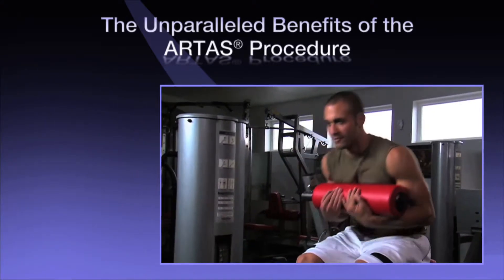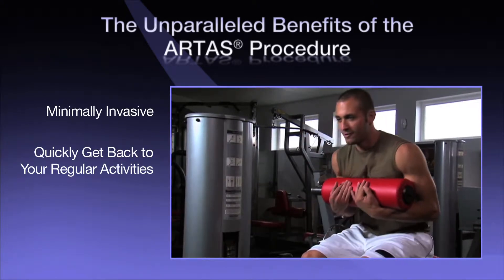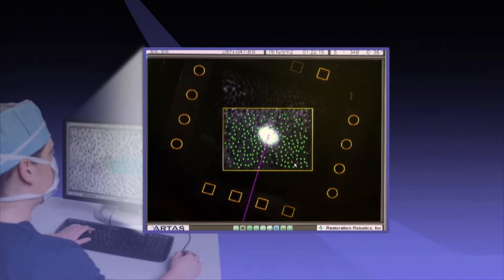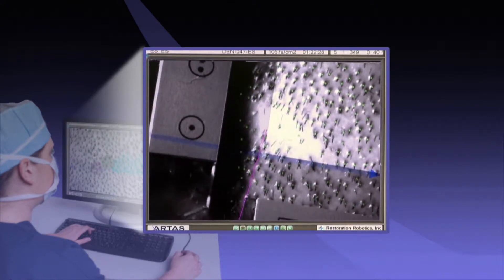The advanced digital technology and precision robotics behind the ARTAS system help deliver a revolutionary hair restoration procedure that is minimally invasive, allows you to quickly get back to your active lifestyle, and delivers consistent, healthy, and natural results. The ARTAS system empowers doctors to digitally identify and track each follicular unit with pinpoint accuracy, calculating parameters such as hair angle, distribution, and density to successfully harvest healthy follicular units for implantation.